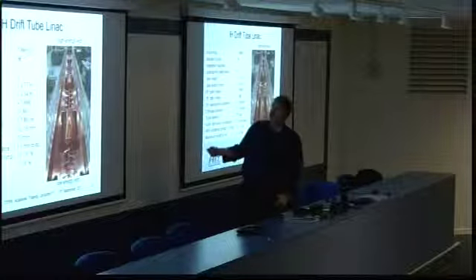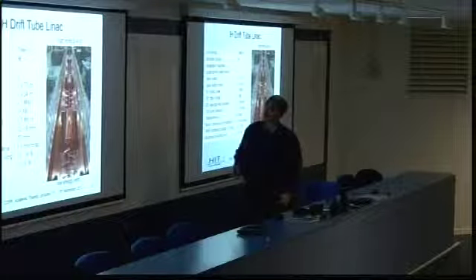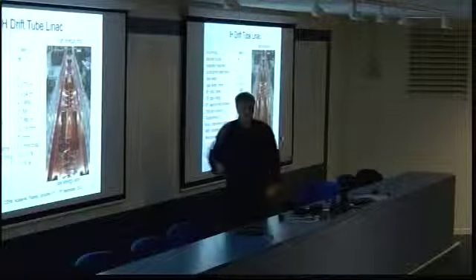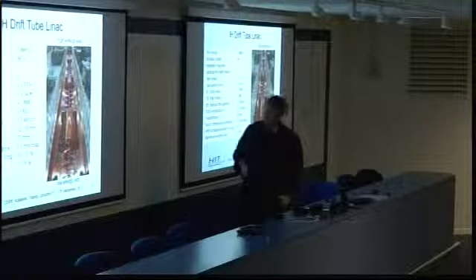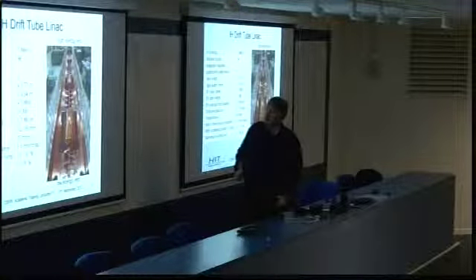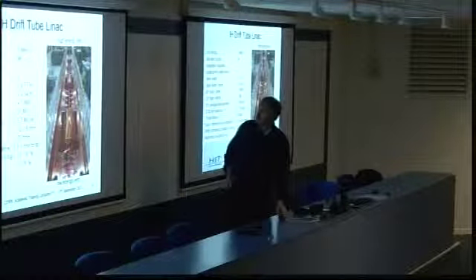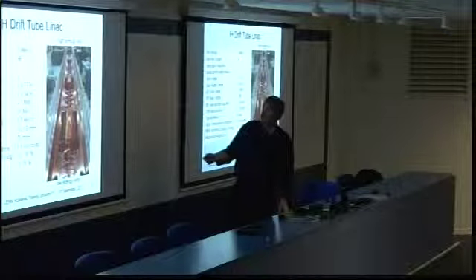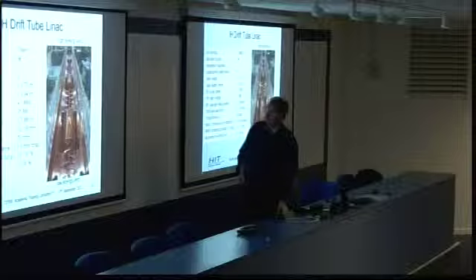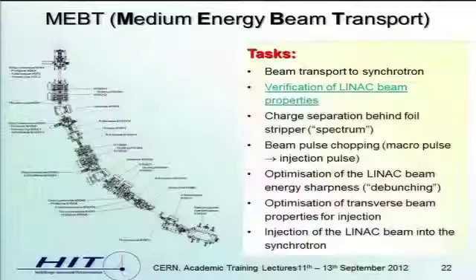Okay, as I said, the length is roughly 4 meters, also a very slim version. The RF power which you need for that is pulse power of roughly a megawatt, which is a lot, but nevertheless this is feasible to do in such a facility. Well, and the rest I can skip, I think. The average field gradient is something between 5 and 6 megavolts per meter. Not bad for such a structure. Okay.